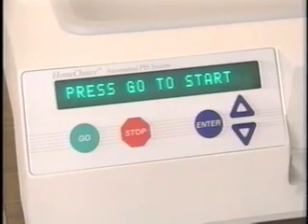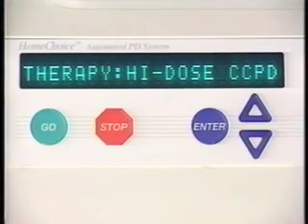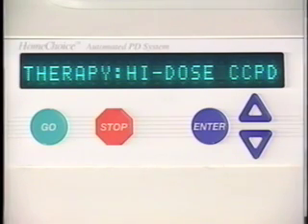press go to start. If high-dose therapy is required, the patient will be able to combine conventional therapies like CCPD or Tidal with additional daytime exchanges. For high-dose therapy, 7 parameters must be programmed. Press the down arrow once.